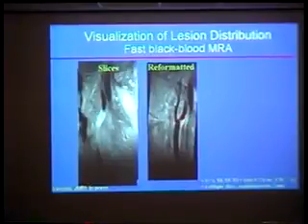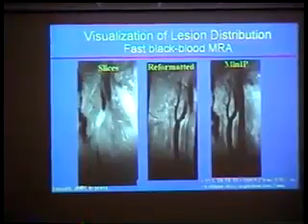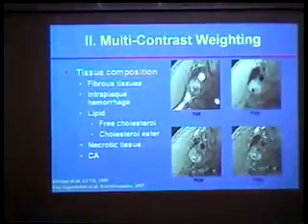And also, with this type of images, when we do this in our protocol, we use this little point here, this little flow divider, as our landmark to realign patients if we want to do them repeatedly, such that each time when we do imaging, we pretty much bring them to the same location. And this type of oblique image, looking at where the bifurcation is and the lesion distribution, we use primarily to obtain the landmark. This is a different view of looking from the same data set.